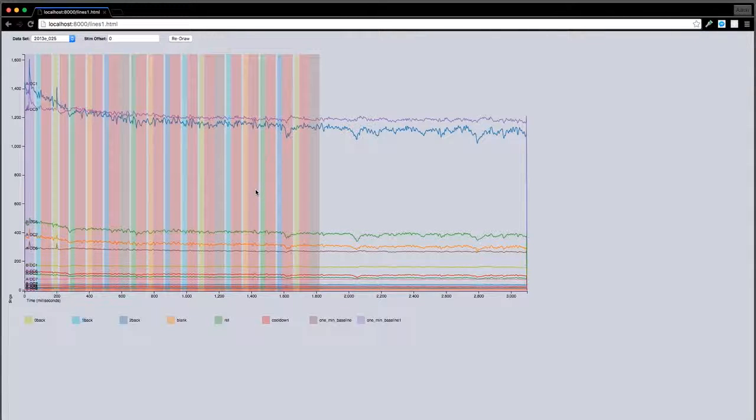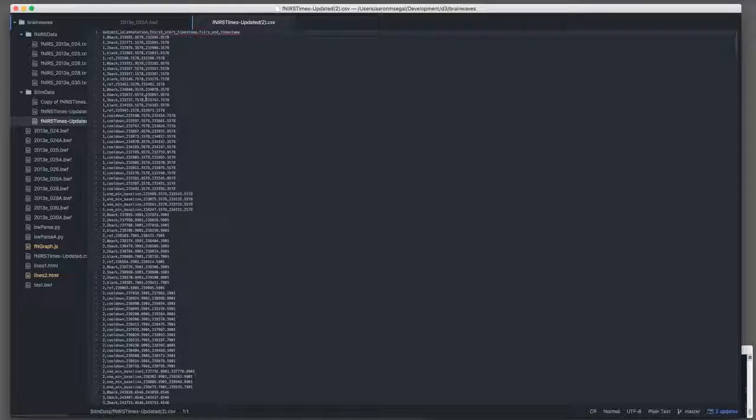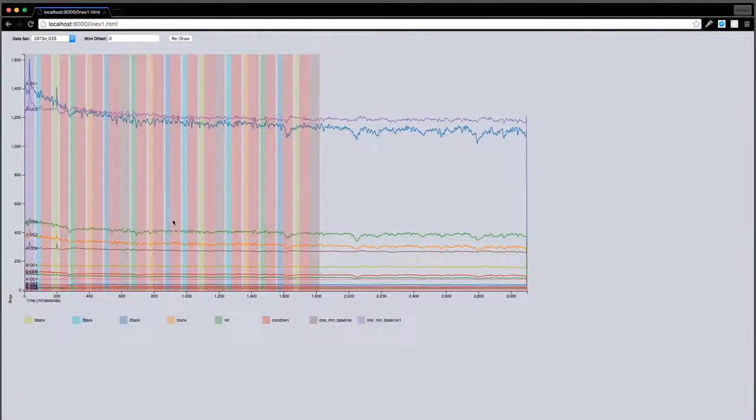Now, one issue that I uncovered in creating this interface is that there was no clear sync point between the data that I was using to get the stimulus activities. And real quick, I'm going to pop back over here and take a look at that. So this is one of those files. This is just a single file that contains all of the stimulus activities for a bunch of different test subjects. And you can see basically what is happening here is you have for each participant the activity and when it started and when it ended in milliseconds.